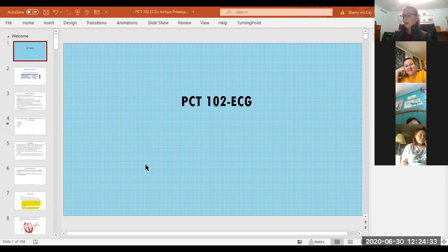Yeah. And then this was which waveform on ECG would indicate a myocardial infarction, and it was the ST segment elevation. If you're caring for a patient with ventricular tachycardia and they become unresponsive, you're going to start CPR.